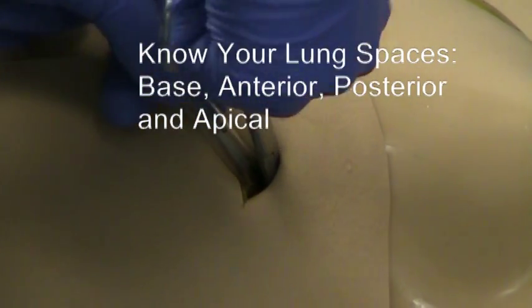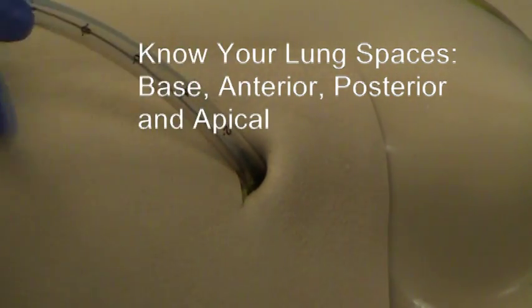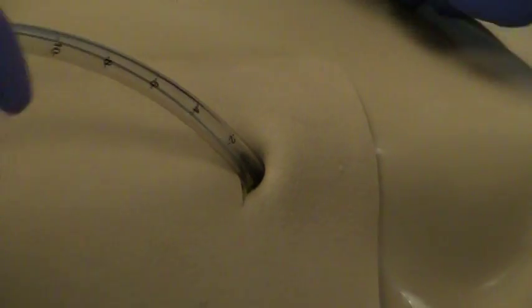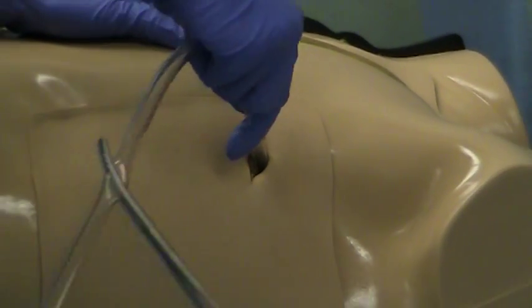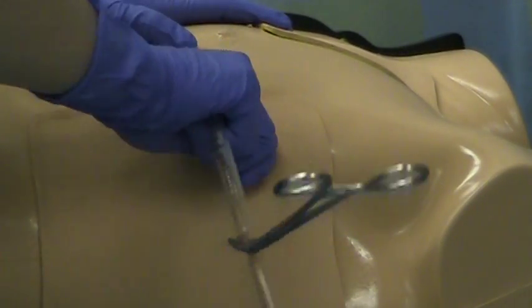Now that I'm in, the other thing I want to make sure that I do is I want to angle this tube so that it will go posterior to the lungs and apical. So the way we do that is to twist it so that we're pushing it down and up as well, and it will lie in the proper position.